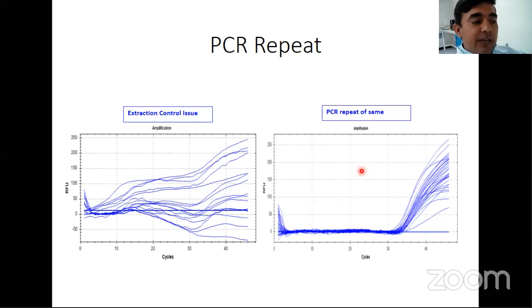Sometimes this happens during the PCR amplification process. Some of the PCR is invalid. Basically, there are no flaws in the extraction process, but the PCR process is invalid. This can be explained with the help of a magnetic bead machine: it is always important that we do not carry any magnetic beads with the template, with the RNA molecule.